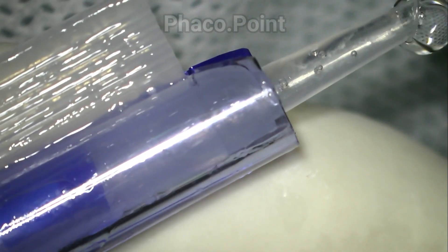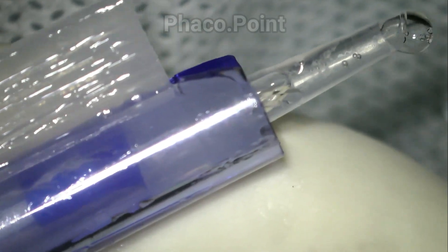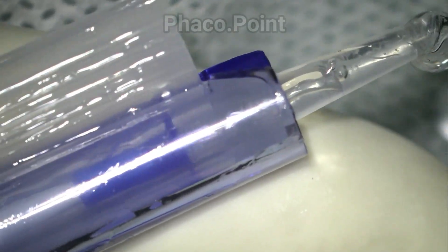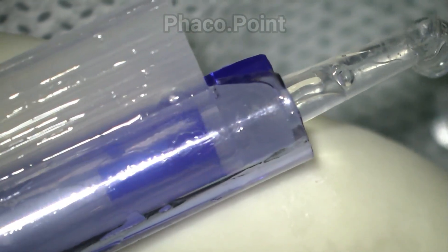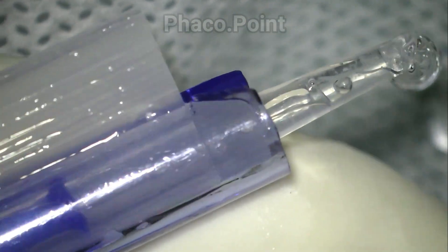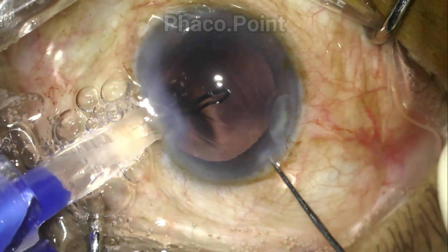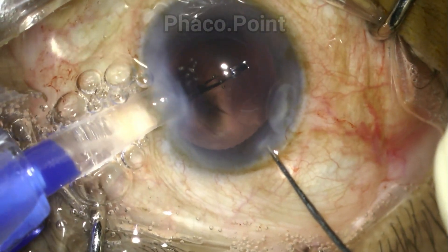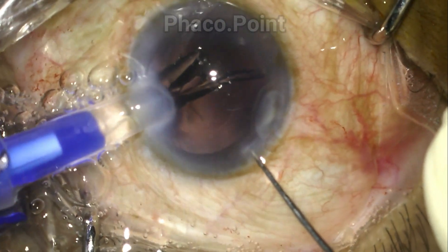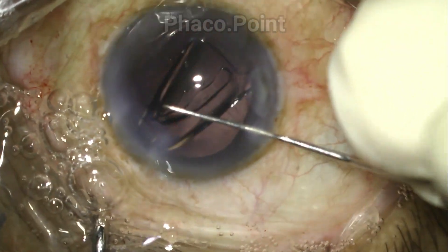This is important: when the surgeon injects the IOL and the tip advances under the microscope, the surgeon intermittently withdraws the plunger and visualizes at this point to ensure that no part of the haptic is jammed between the plunger and the cartridge. This maneuver consistently prevents the haptic from becoming stuck.